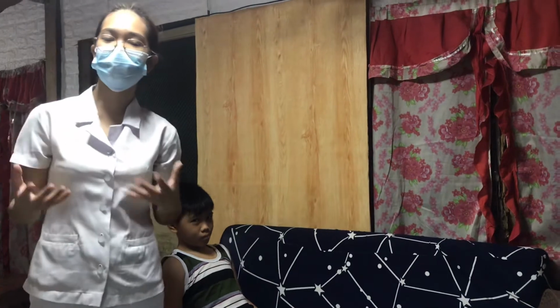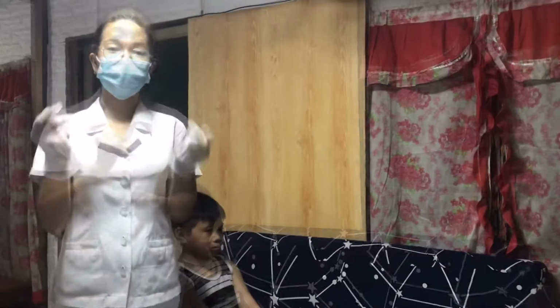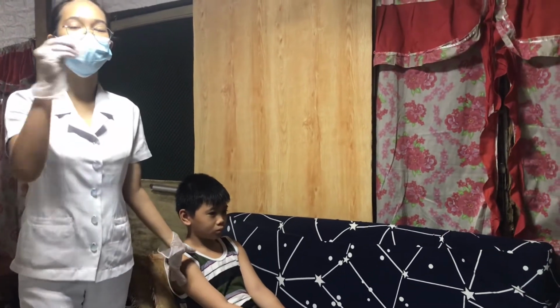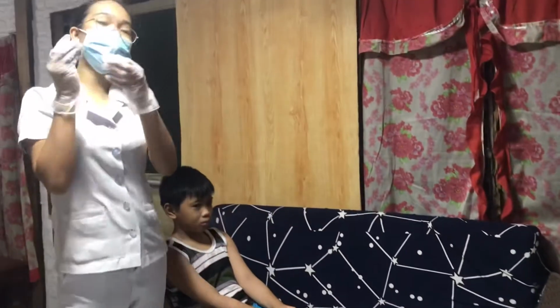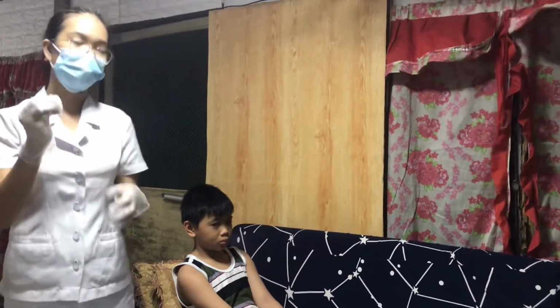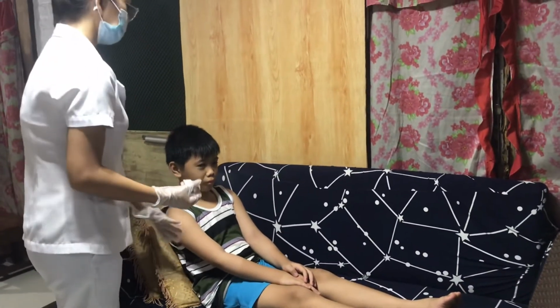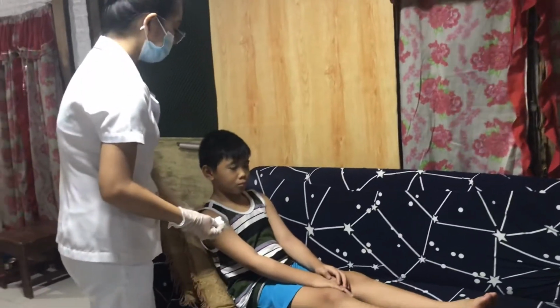So after applying the gloves, let's go ahead and use an antiseptic swab to clean the injection site in an inner to outer motion. So let's pretend that this is an antiseptic swab. Again, sir, hi, good day. I will be cleaning this part of your body because I will be injecting your medication in this part. Okay.